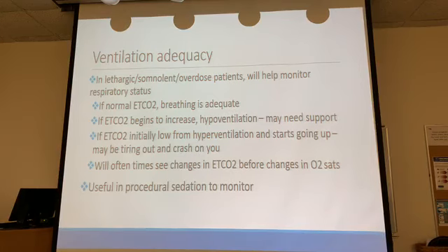Well, the O2 sat's 98%, so they must be breathing okay if their O2 sats are 98%, 100% on room air. Well, not necessarily, because people can have enough oxygenation going on, but that doesn't mean they're breathing appropriately, right? If I'm taking very shallow breaths and I'm only breathing 8 times a minute, I might still have an O2 sat of 100%, but that doesn't necessarily mean that I'm ventilating properly. I'm not blowing the CO2 off properly.